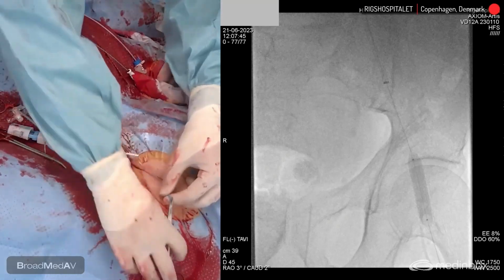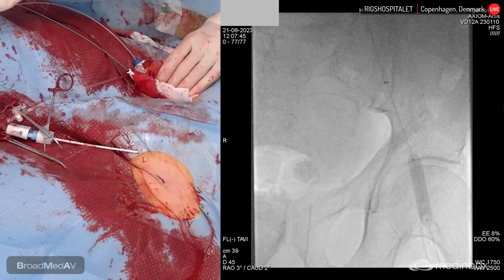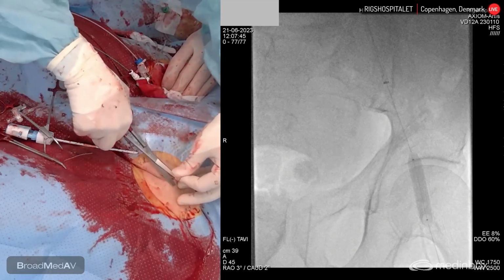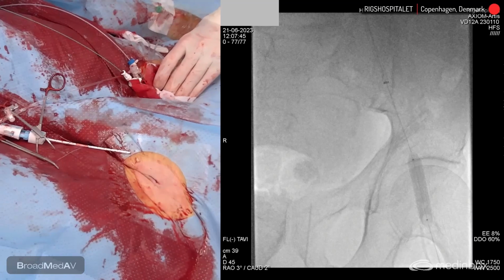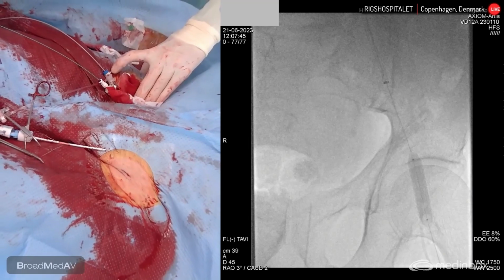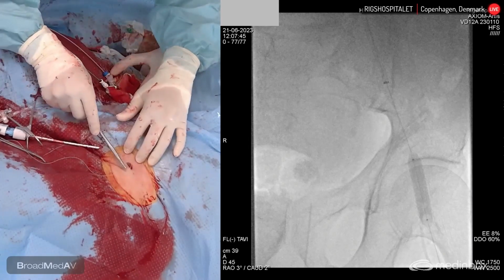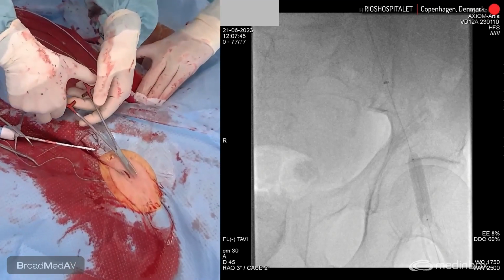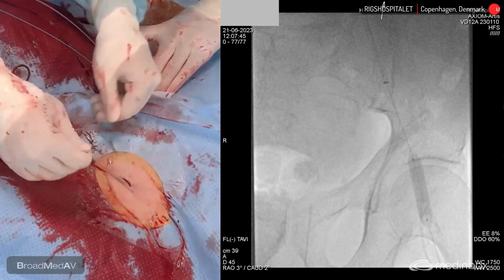Okay, good. All right, you can cut everything to roll again. Yep. So we close the whole thing. So then we just do the control angio with a couple of cc's of contrast, just to profile the contralateral arteries. And that's the first one we're going to close, and then we close the other one, because otherwise it will still interfere with our ProStyle.